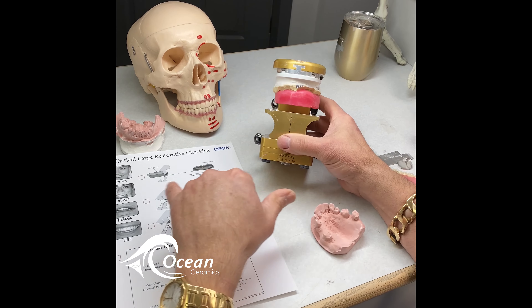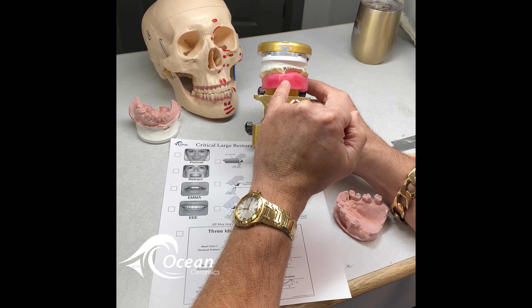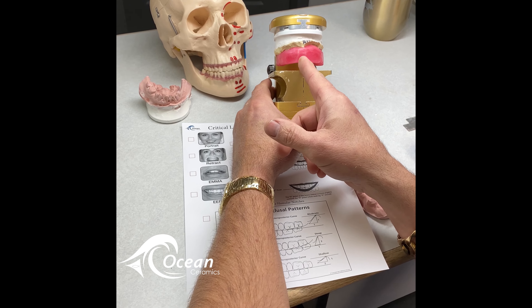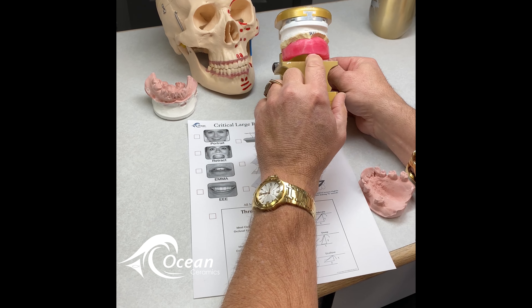First — always, always capture, whether it's on this model, or before you make the denture, or after — capture the hamular notches and incisive papilla.